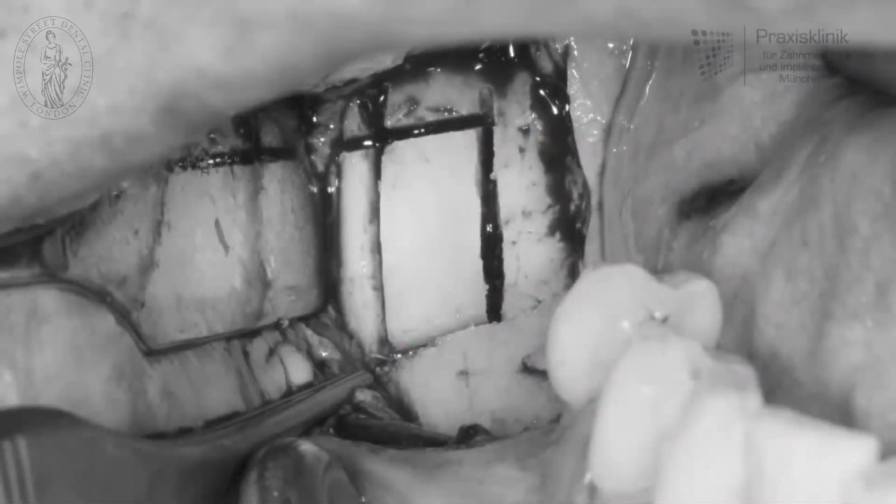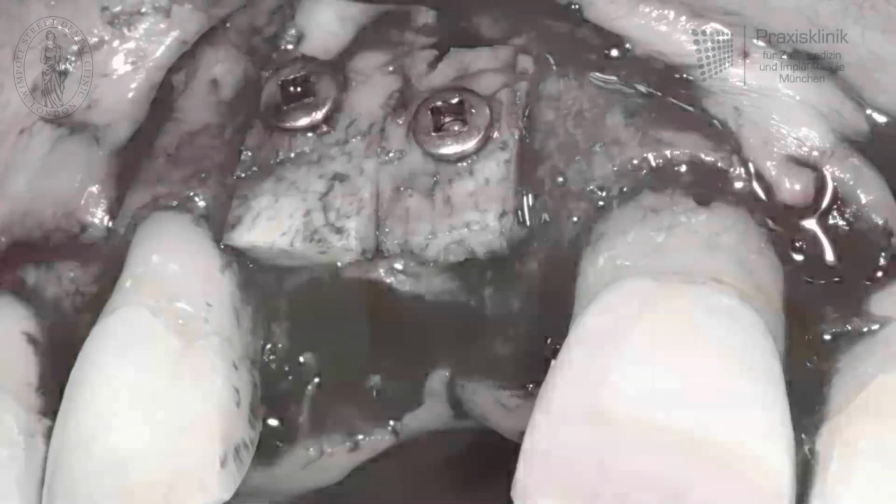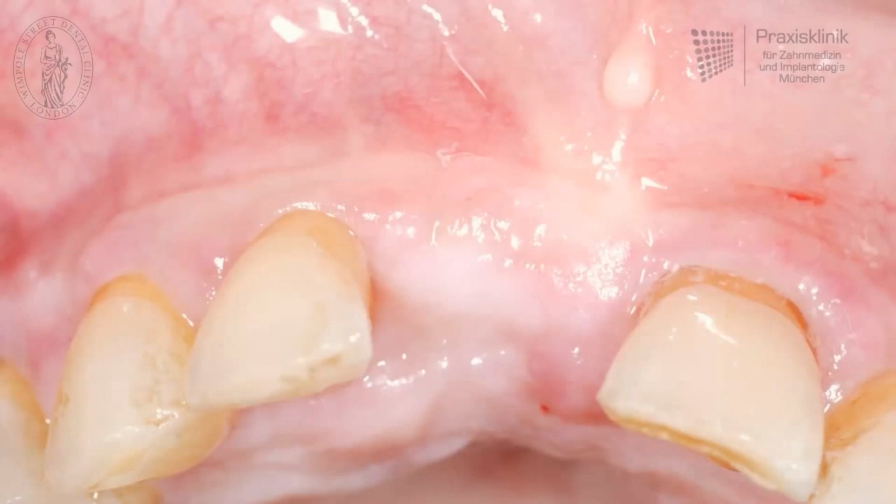This intraoperative picture shows how the bone block is separated from the lower jaw. To free the bone, oscillating instruments and very fine chisels are used. Now the bone block is transferred to the recipient site of the upper jaw. There it is adapted to the geometry of the defect, and the bone block is then fixated by 2 titanium screws.